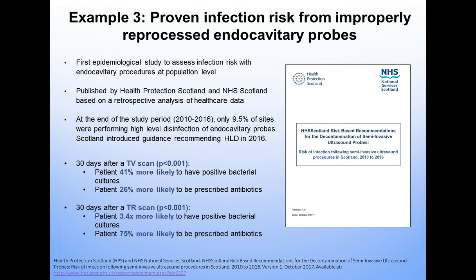And so what the authors found when they compared the control group, who were matched patients who did not have ultrasound, and for transvaginal they were OBGYN patients who did not have ultrasound, they found that patients undergoing transvaginal scan were 41% more likely to have positive cultures and 26% more likely to be prescribed antibiotics in the 30 days following a procedure. And it should be pointed out that the prescription of antibiotics and the ordering of those cultures was typically done by the primary healthcare provider and not necessarily done by the same site that had performed the transvaginal ultrasound, i.e. the hospital.